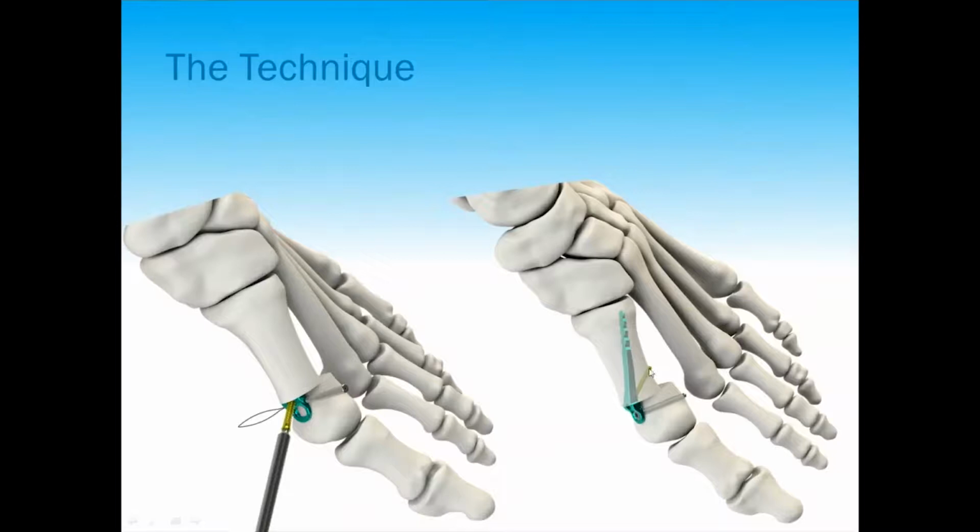And then what I do is, that sets the capital fragment translation, but you want to make sure you get your angulation correct and your rotation. Your angulation typically does not need to be adjusted because it's a flat cut and it sits flat and it doesn't angle on you. But sometimes with larger bunions, larger shift, it may want to angle medial or lateral, and you have to look at that. And then you can get your rotation.